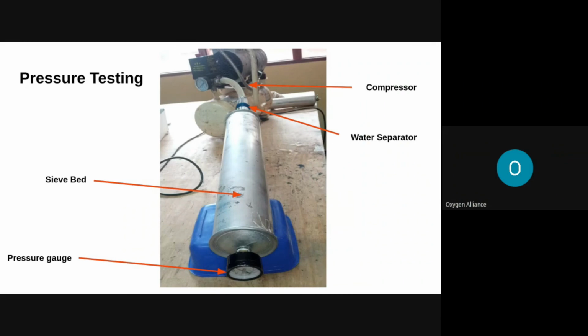So remember, the O-ring is soft. Sometimes when you're closing the sieve bed, you might damage the O-ring by tearing it on the sides. That can introduce some leakages. Another cause might be a tilted cup or a tilted end cup.